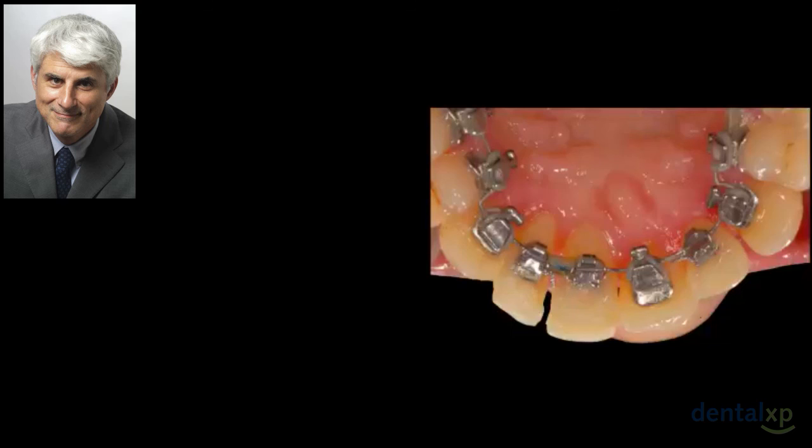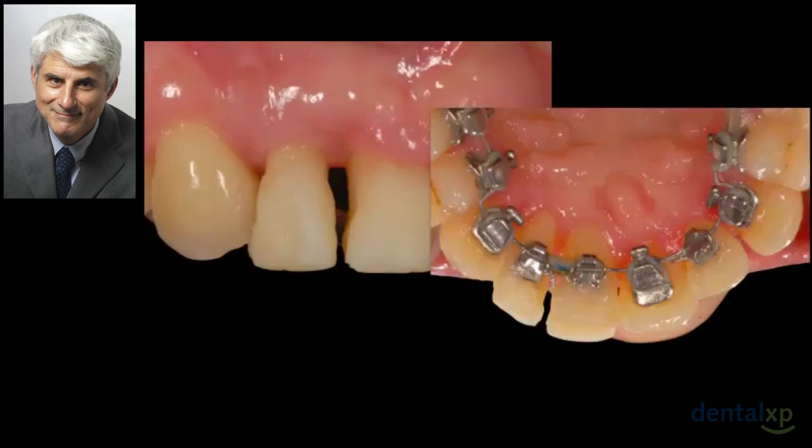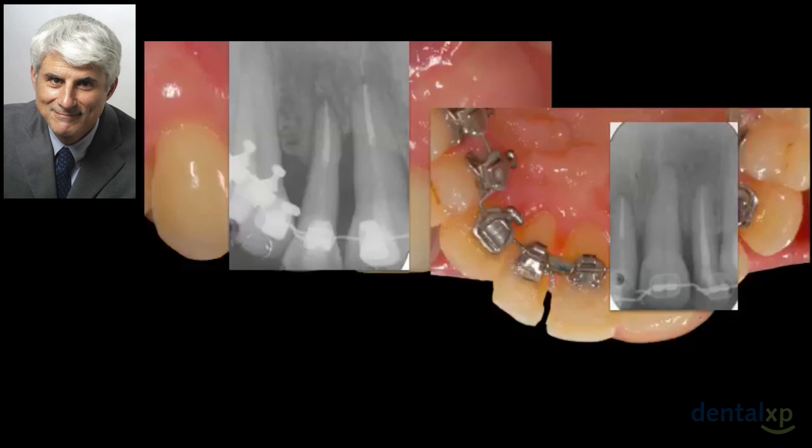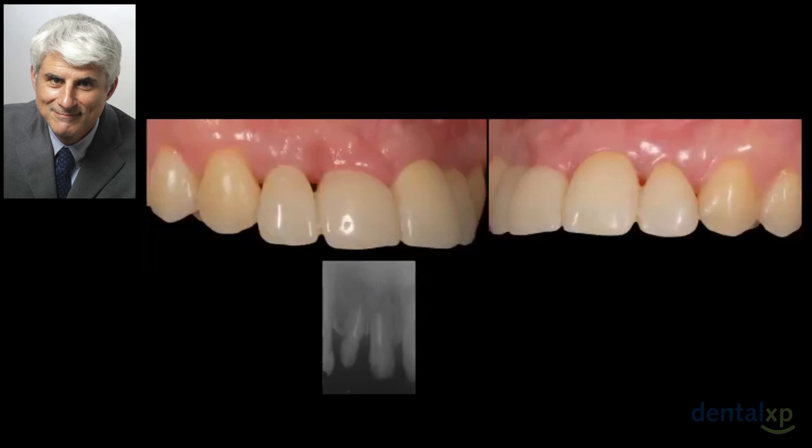So the ortho treatment lasted quite long, and at the end of the treatment, we were able to arrive to this point when the tissue were stabilized and the tissue were healthy. So we took again X-rays. The patient at this moment had finished the ortho treatment, and we stabilized on temporaries. This is the situation at the moment with the temporaries. And we are planning some minor adjustments.